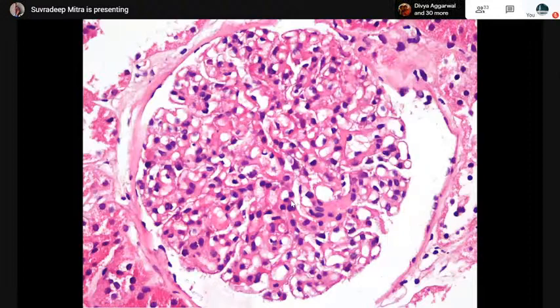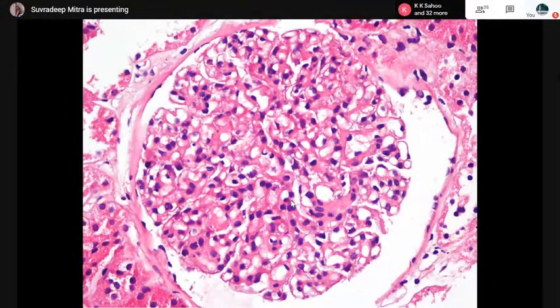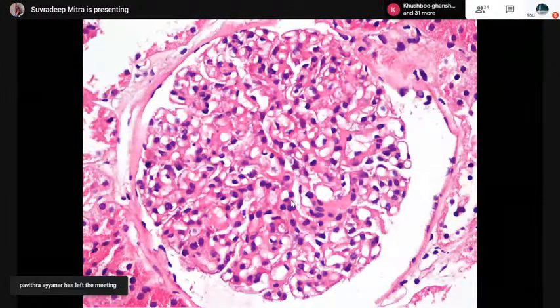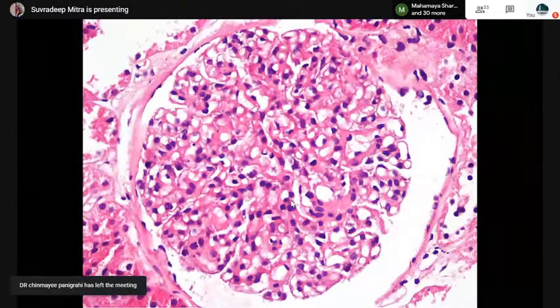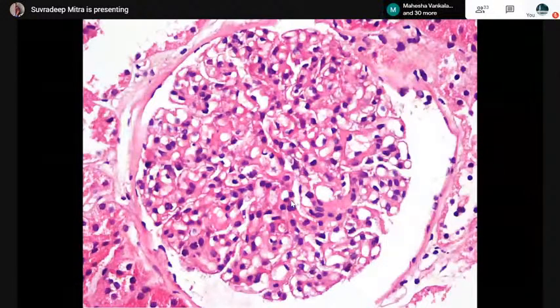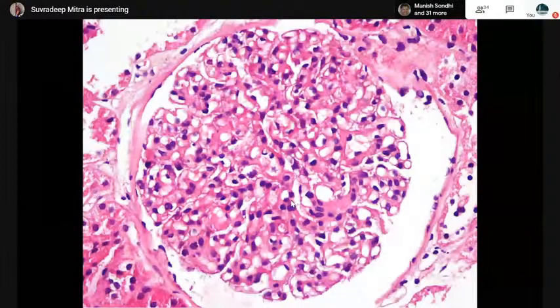All of you obviously can understand this to be a glomerulus. For the postgraduates especially, I must tell you that in your practice, the majority of the time you will find cases with glomerular pathology. However, you can also find interstitial and tubular pathology as well as vascular pathology. When we report a renal biopsy, we dominantly see the biopsy in 3 compartments, namely the glomerulus, the tubulointerstitium, and the vessels. So I will concentrate more on the glomerulus in the kidney biopsy because that's practically more important from your point of view.